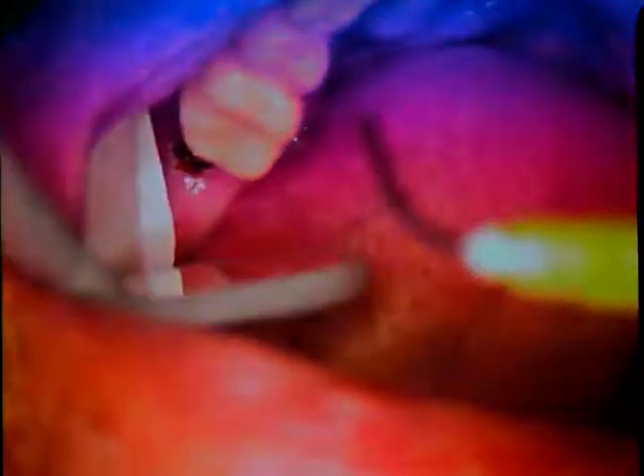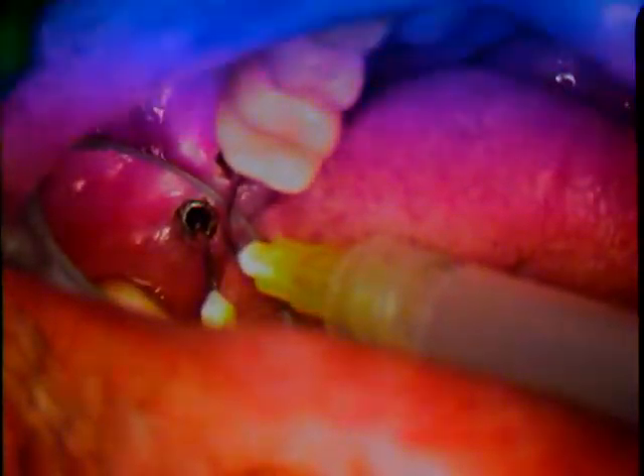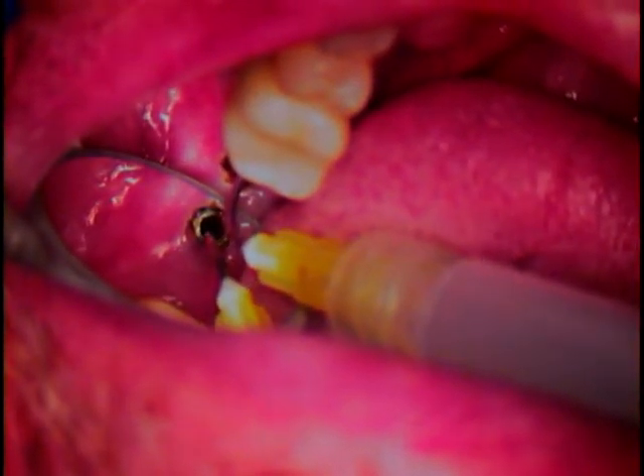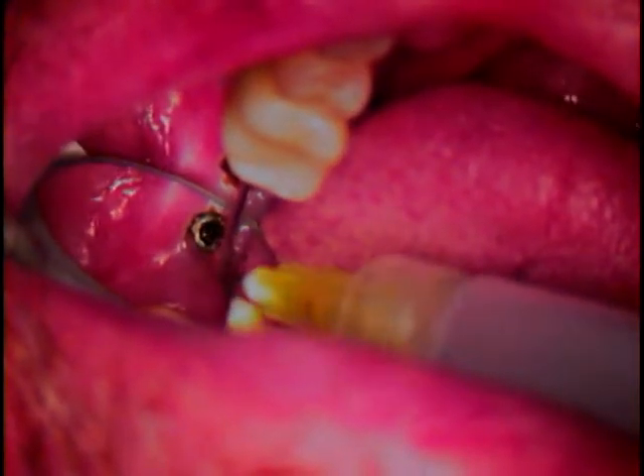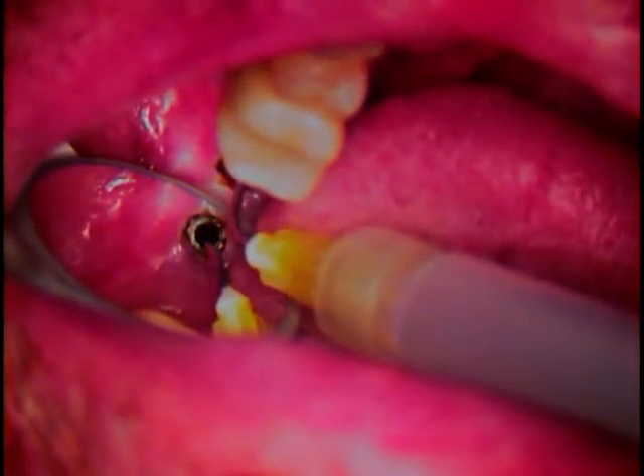Now we're going to go in and use micro suction. So this is the tip — it's a small gauge, 20-gauge component. I'm going to go all the way down inside to the base of the implant. Complete base. All the way down. Perfect fit.